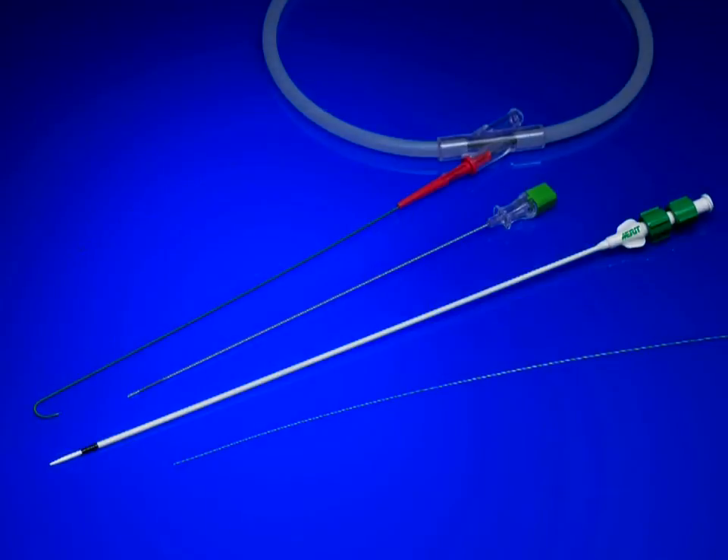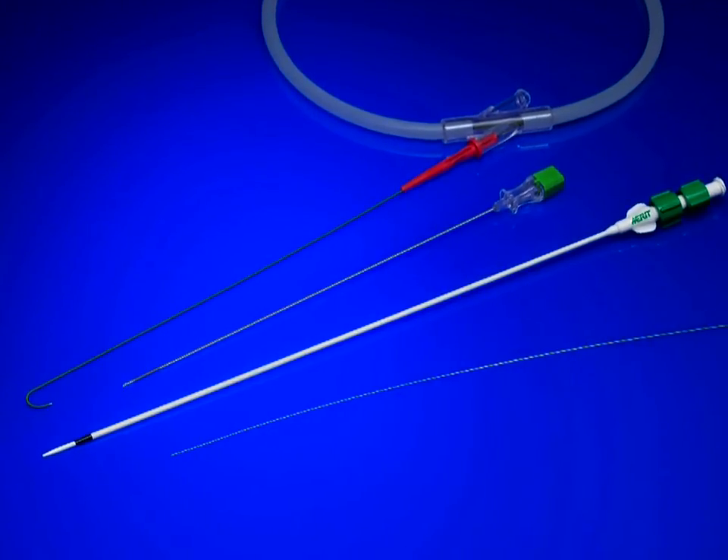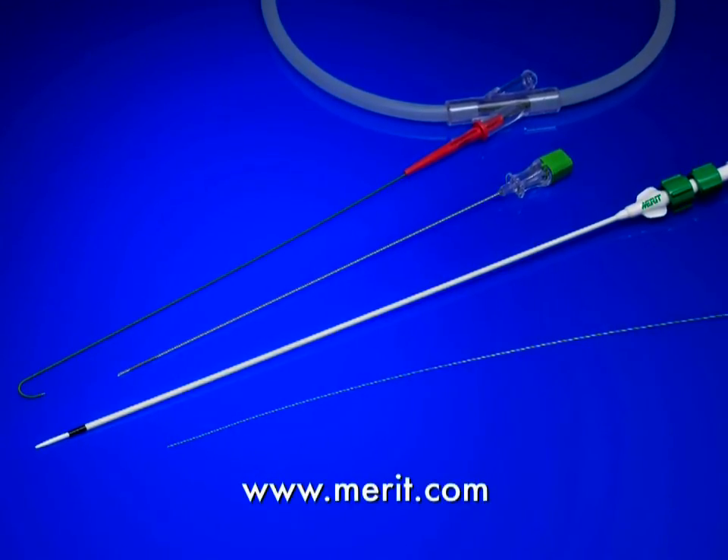To place an order today, contact your local Merit Medical sales representative, or for more product information, visit the Merit Medical website at merit.com.